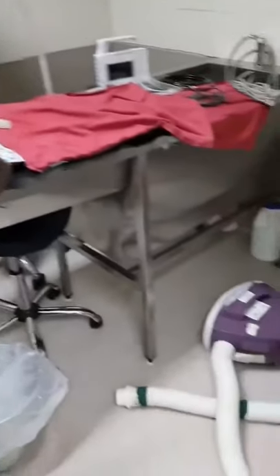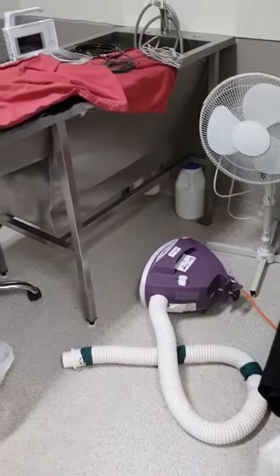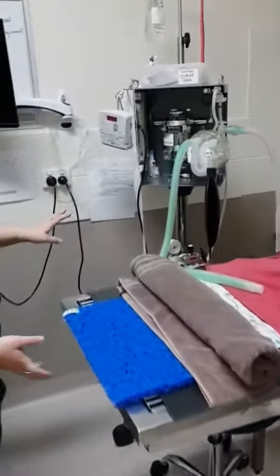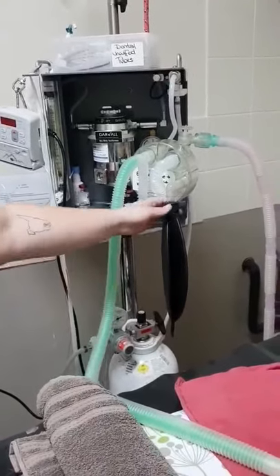We also have the bear hugger, which then turns on. We also have our anaesthetic machine, which we will have a circuit on. Here we have a larger circuit and we also have a 3-litre bag.